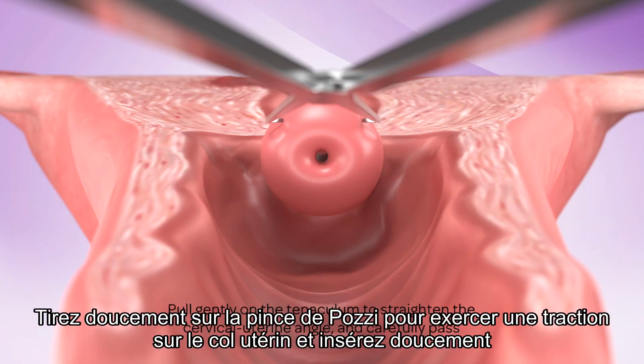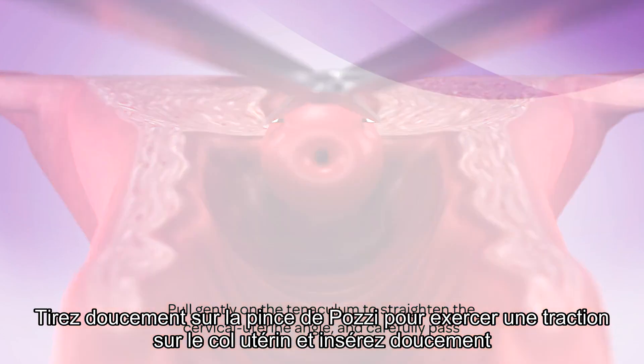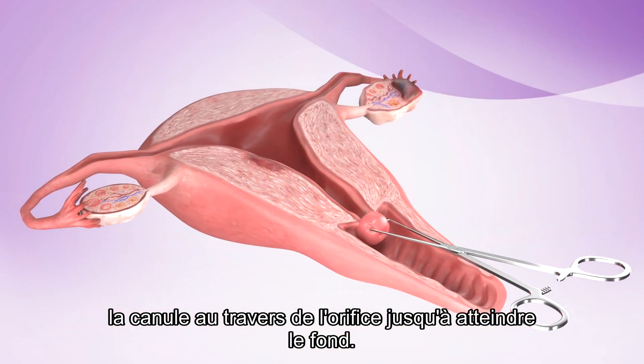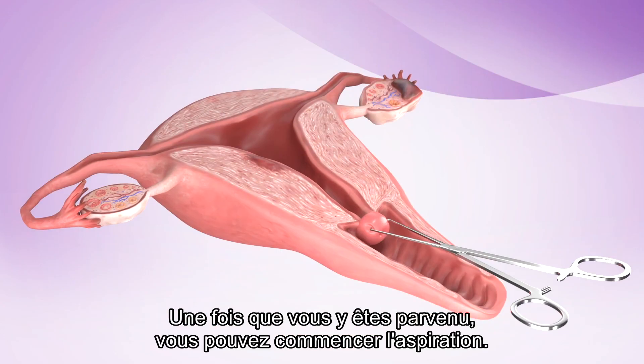Hold gently on the tenaculum to straighten the cervical-uterine angle and carefully pass the cannula through the os and advance it to the fundus. If successful, you can begin the aspiration.